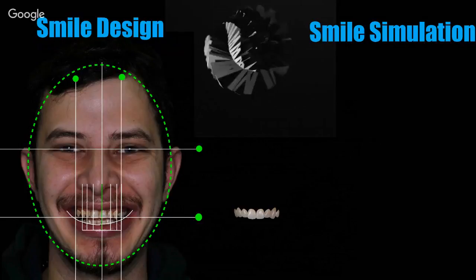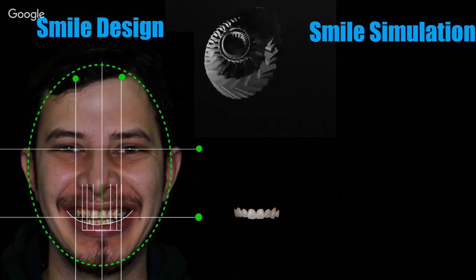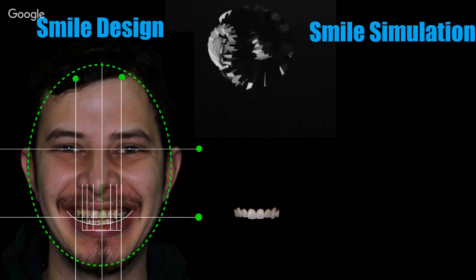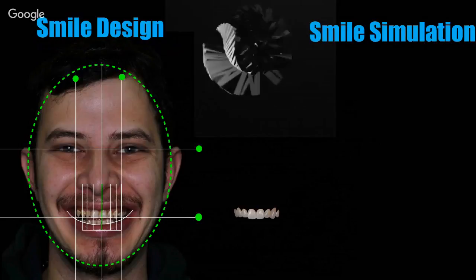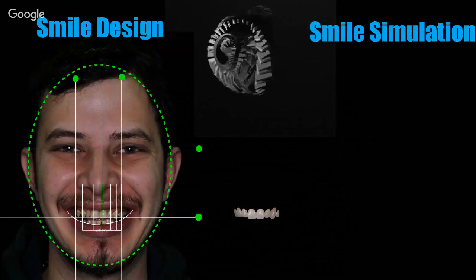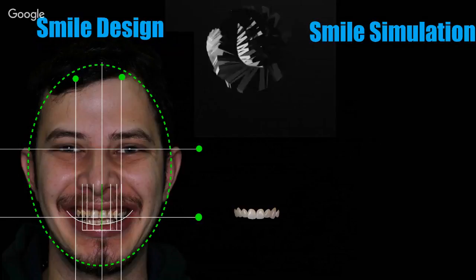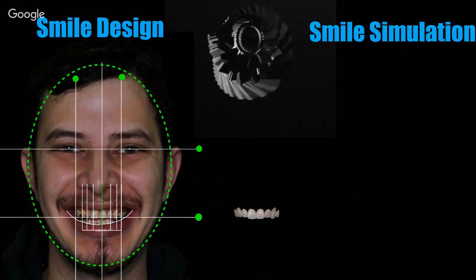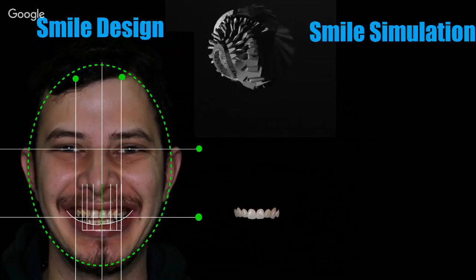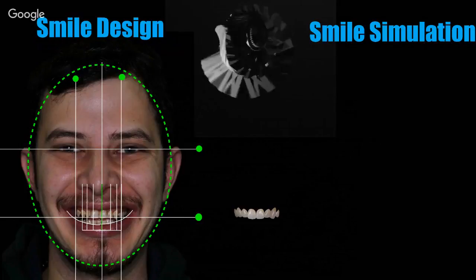All of this is done for the dentist's sake. So when you do all of this work, you draw the interpupillary line, draw the face midline, draw the teeth midline. All of this is planning performed to help you execute the clinical case. I mean, to do it well. All of this eventually is for the dentist. That's what I mean to say.